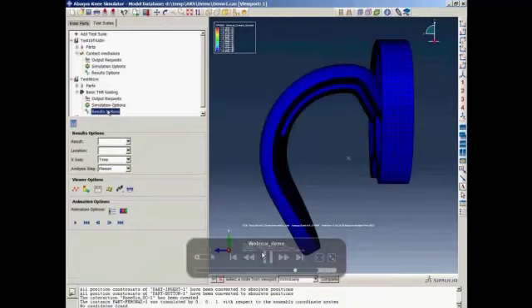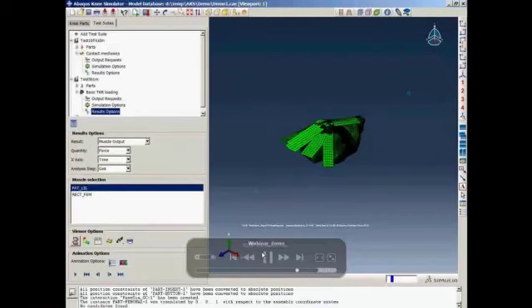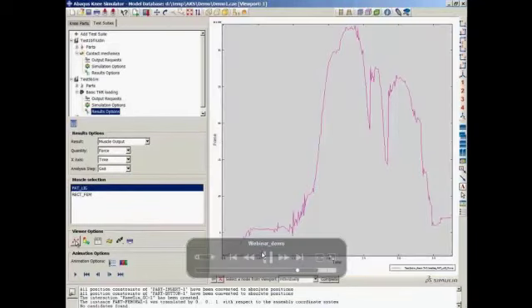Next, we move on to the visualization of the basic total knee replacement workflow. In this case, there are more output variables available for different loading conditions. In this case, I choose the muscle output, plot the force over the gait cycle, and I pick the patella ligaments. Then the outputs over time, over the gait cycle for this specific ligament is plotted.